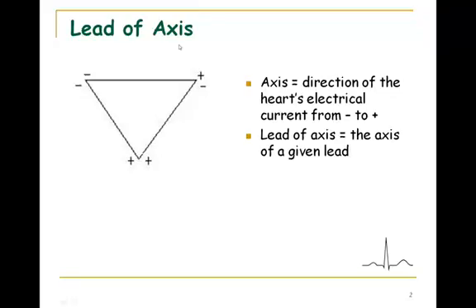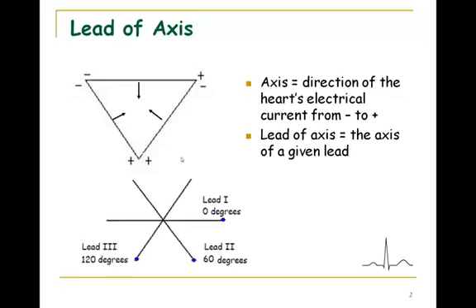If you take these 3 limb leads, you break apart this equilateral triangle, you collapse them and superimpose them over the heart. What you're going to get is something that looks like this. So you'll notice with standard limb lead 1, which is right here, I moved it down towards the heart, which you see here. The positive recording electrode for standard limb lead 1, which is placed on your left wrist, is considered to be 0 degrees relative to the heart.